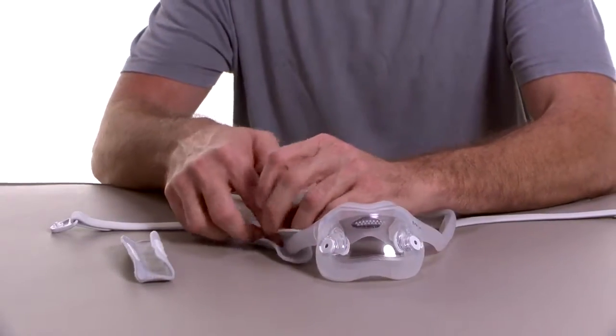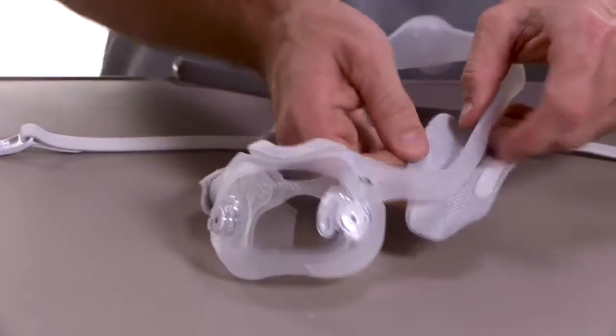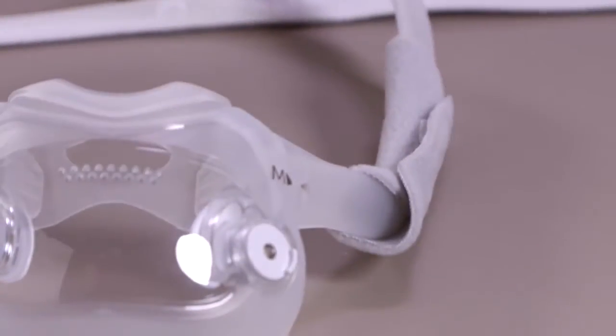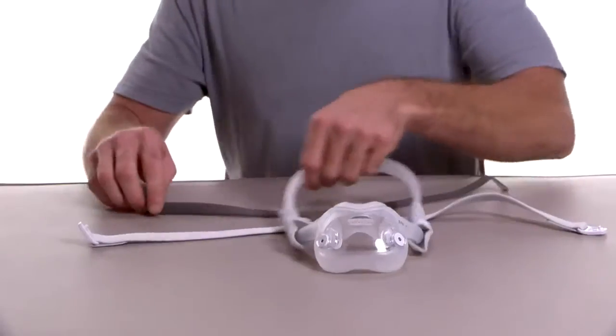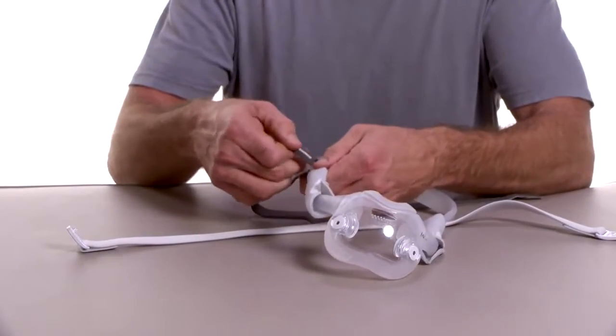Wrap the optional fabric sleeves around the mask frame so that the seams are on the outside, away from your face. Press the strips together to attach the sleeves. Now slide the tabs on the headgear into the slots on the mask frame and fold them backwards.